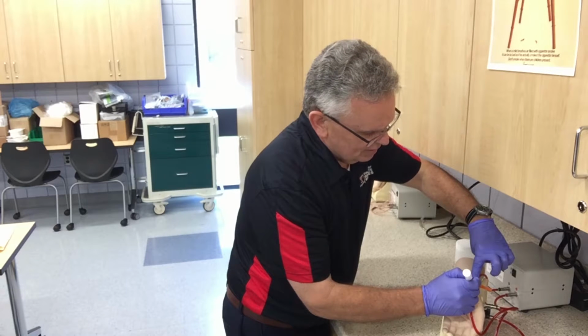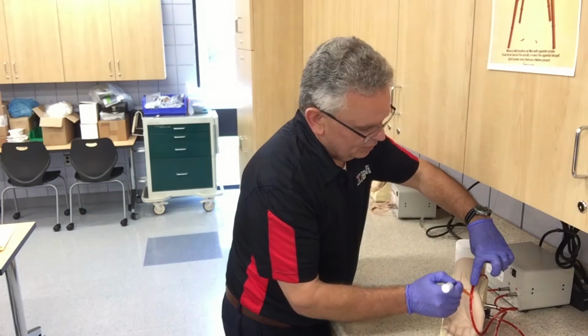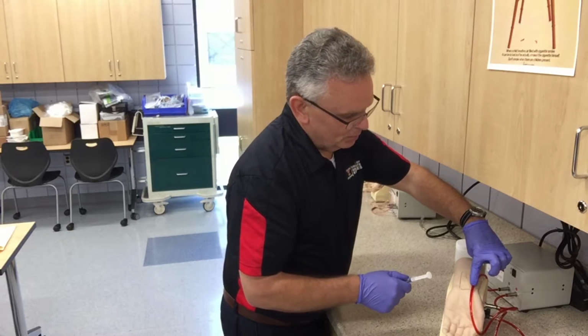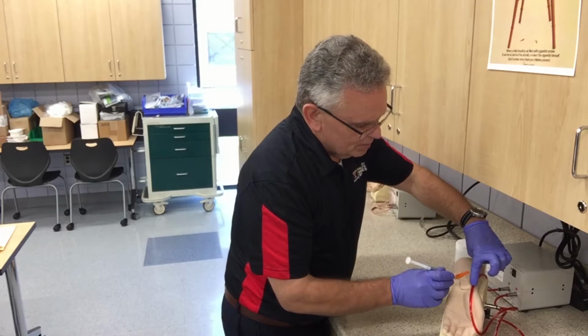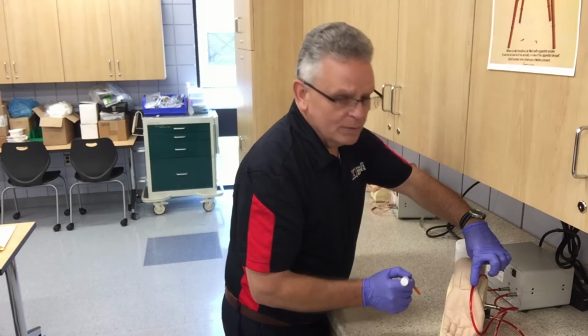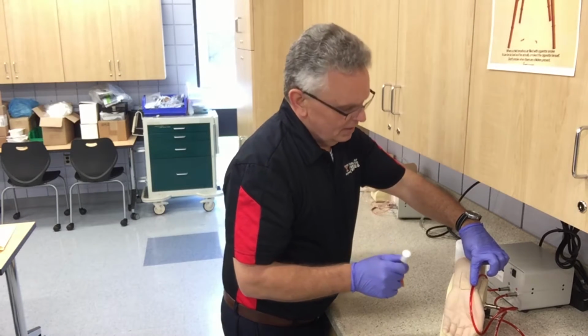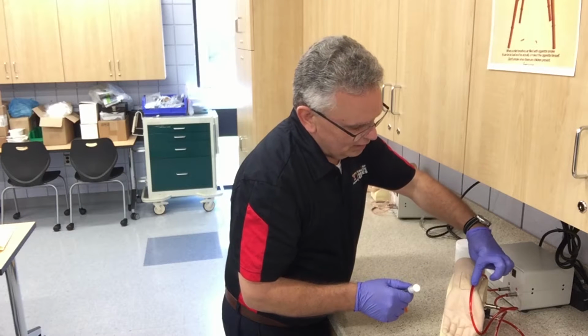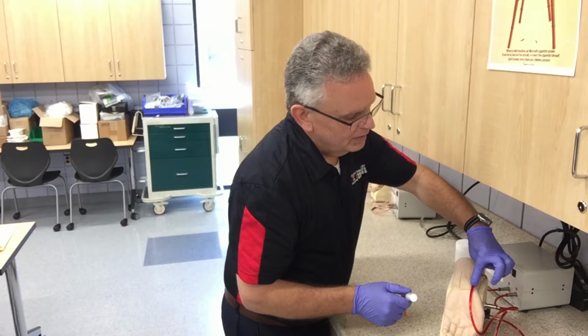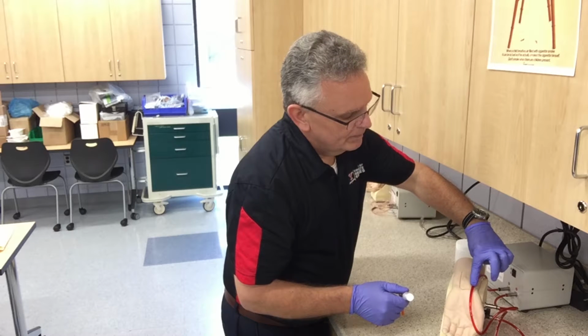By aligning it with the center of your finger, you should be able to hit the center of that artery, get your needle into the lumen of that vessel, and obtain an adequate arterial sample. Even if you should miss by a tiny bit, you'll probably still hit the artery itself and be able to obtain an adequate sample. That's one of the beauties of making sure that you're aligned with the center of the artery. You have a little bit of room for error.